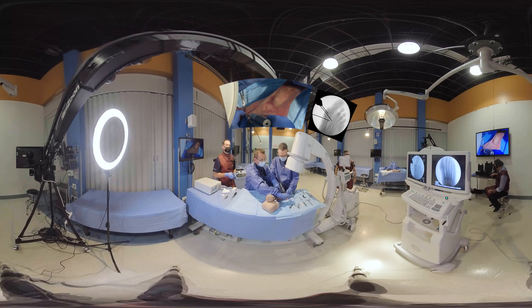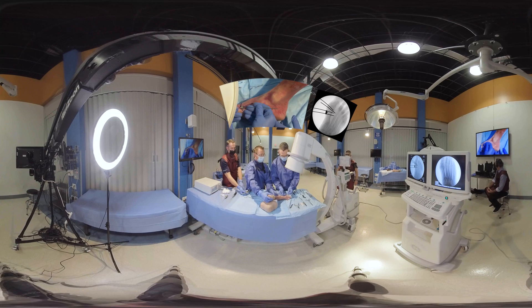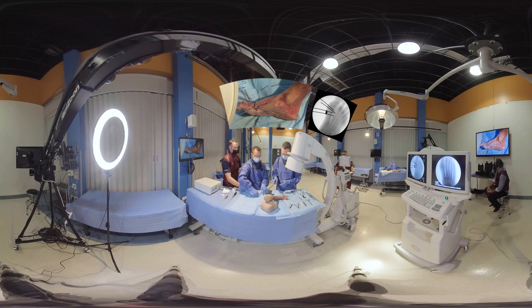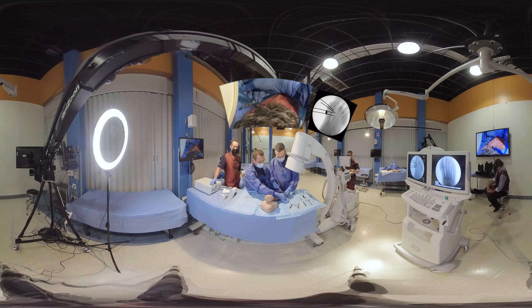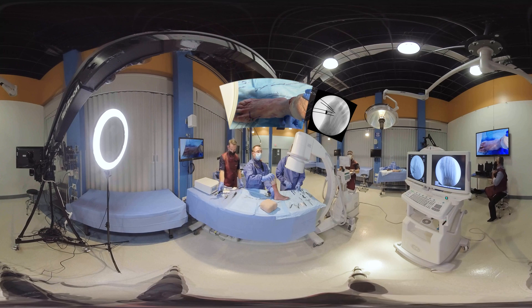Now we're going to put this guide in, so it's 90 degrees to our lateral line and 90 degrees to the sagittal plane. What I'll do is bend these wires to allow my saw to enter into the guide. And we're going to protect the skin as we do our osteotomy. You can basically create a trough or a starting cut and then finish it off after you remove the guide, or you can just cut it through and through. There's our osteotomy.